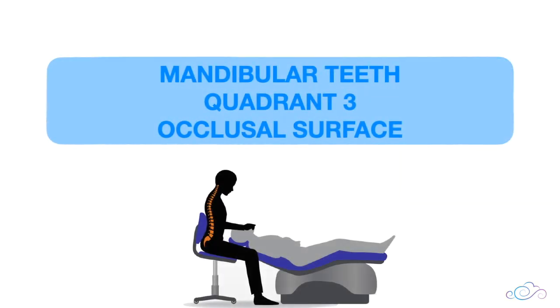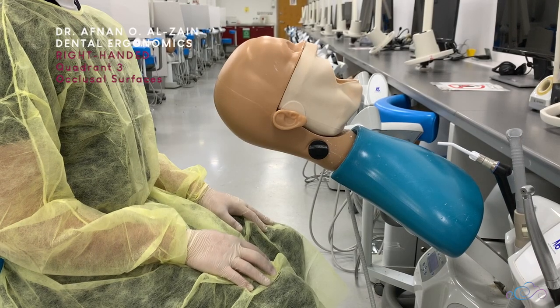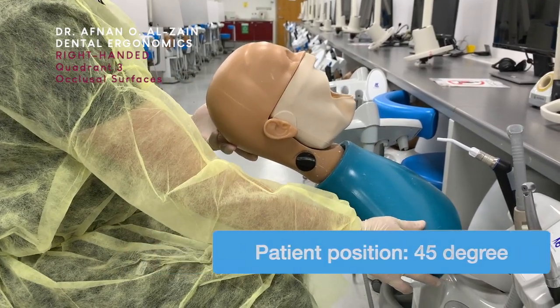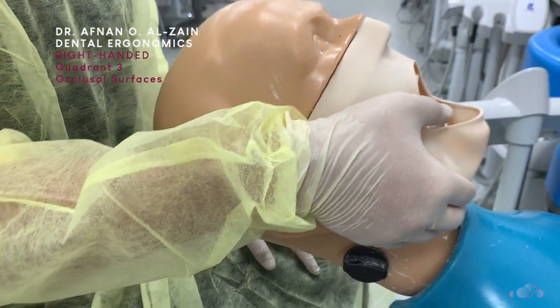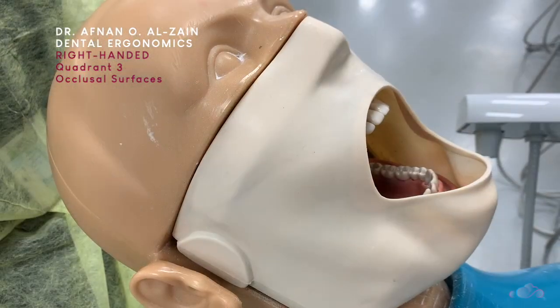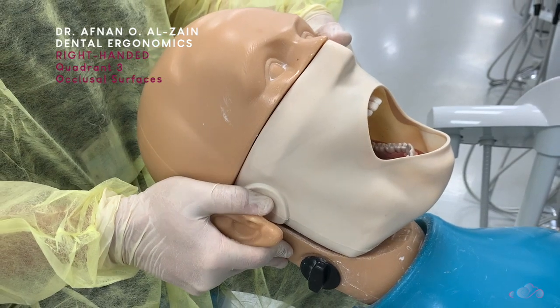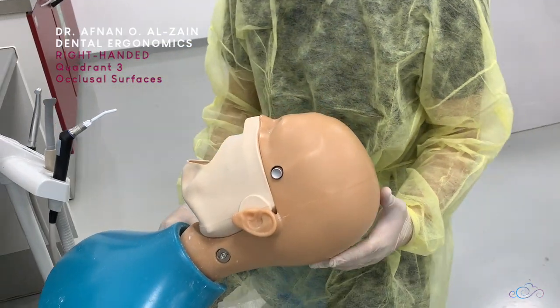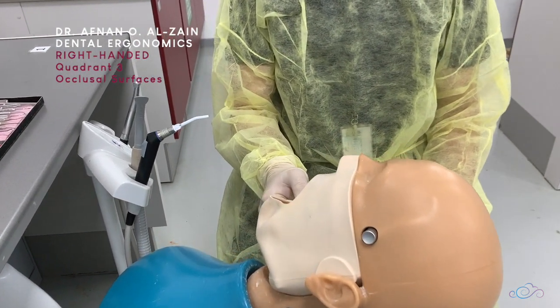Let's start with the ergonomics of the occlusal surfaces of quadrant three. When working on mandibular teeth, you're going to place the patient or the sim head at a 45-degree angle, making sure that the occlusal plane is at 45 degrees at the same level of your elbow. For right-handed students, you're going to tilt the patient head a little bit to the right. When working in lower quadrants, you're going to go either in a right rear position, right position, or frontal position.